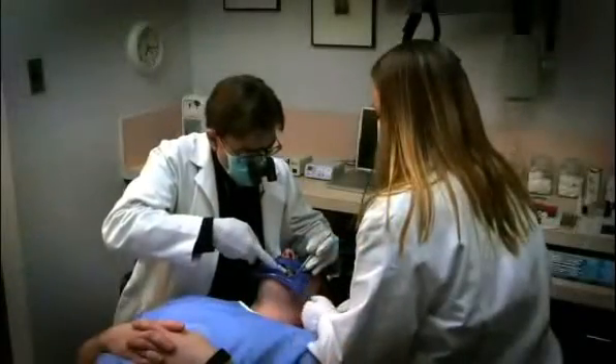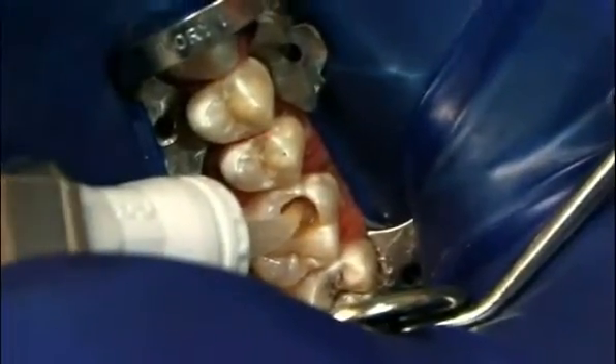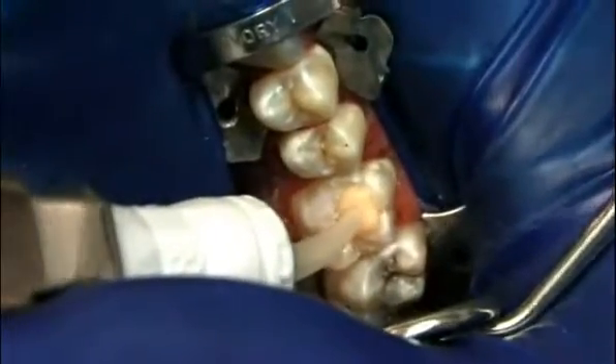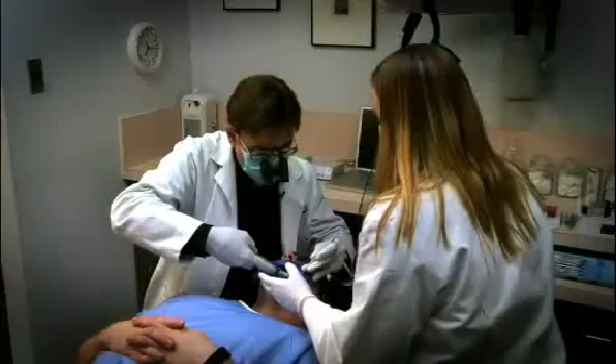The working time is 1 minute and 15 seconds from the beginning of the mix. Place the Fuji 9 GP Extra capsule applicator tip to the base of the preparation and slowly extrude the material to the occlusal surface while removing the tip slowly. This technique prevents incorporation of voids.